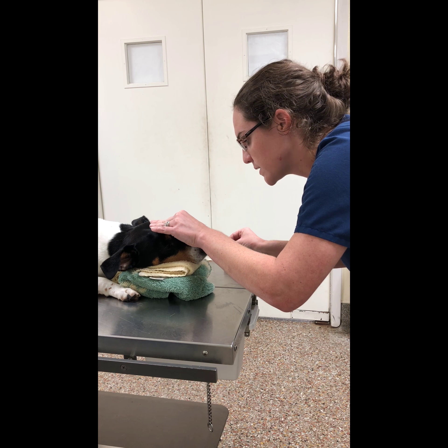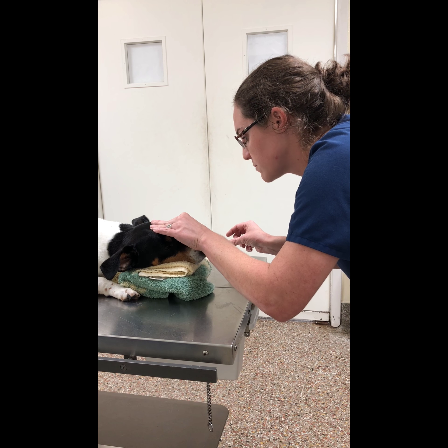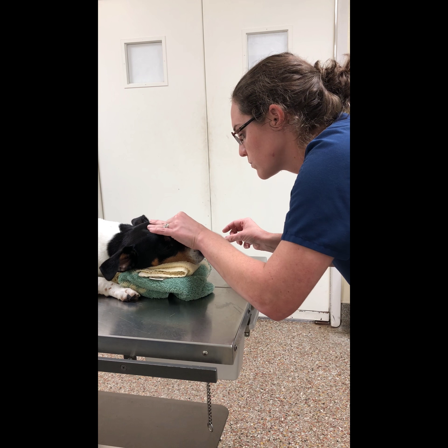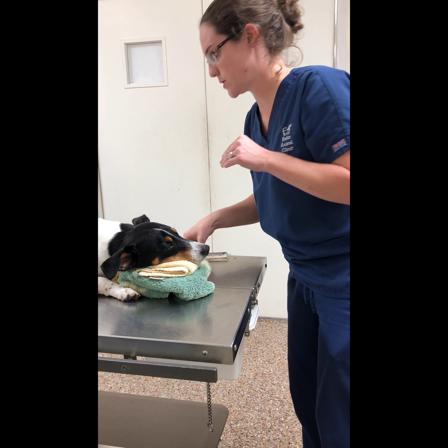Normally you would get the pet to blink a couple of times, but since he is sedated, I'm just going to maneuver the eye to where it will open and close a little bit.